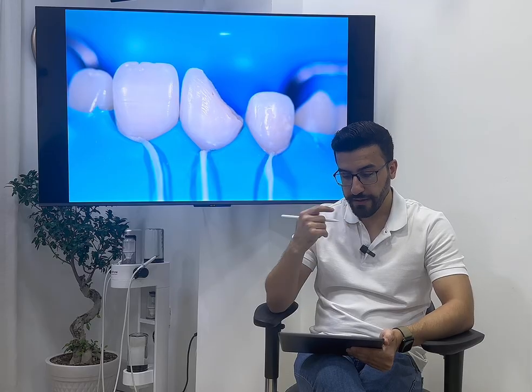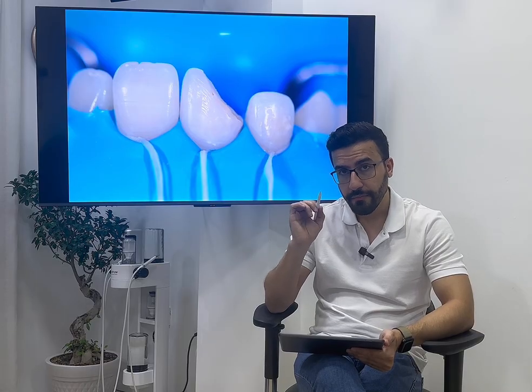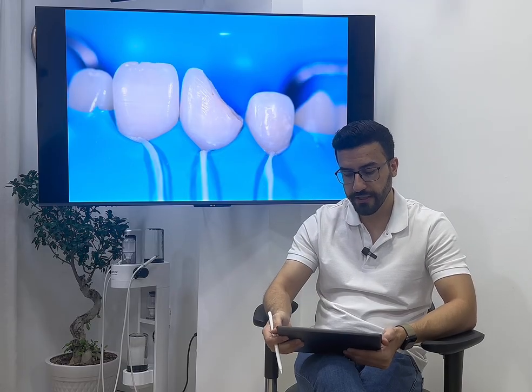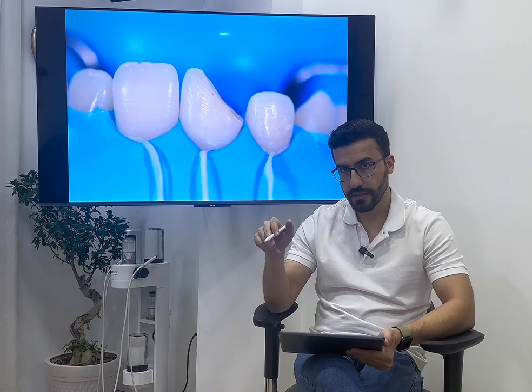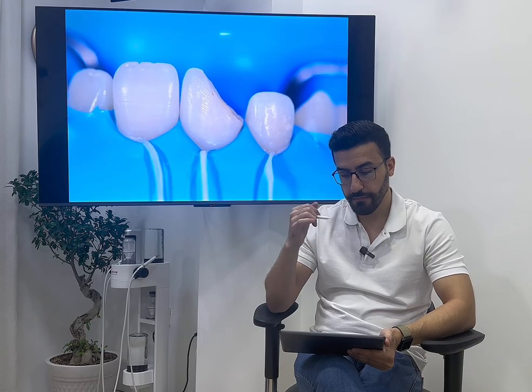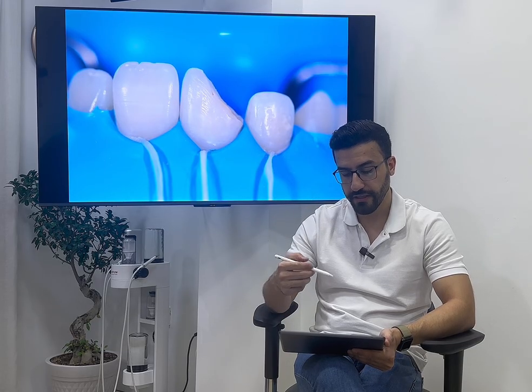So before starting, I have to do my shade selection. So just keep in mind, don't make your shade selection on the rubber dam for two reasons. You have more light reflection than usual, because the rubber dam reflects light. So this is tip number one. You will make a mistake of selecting the wrong shade because of the light reflection.